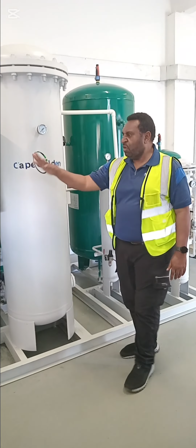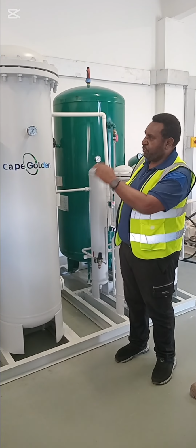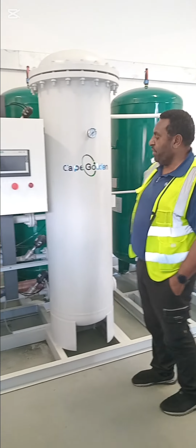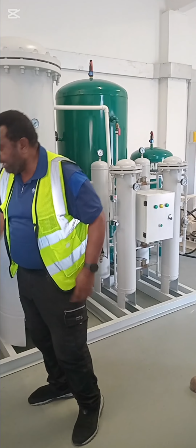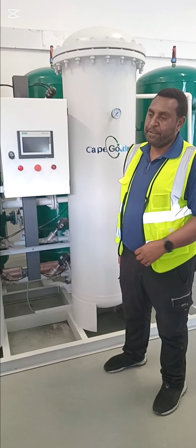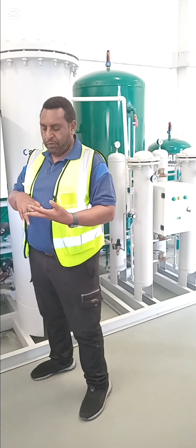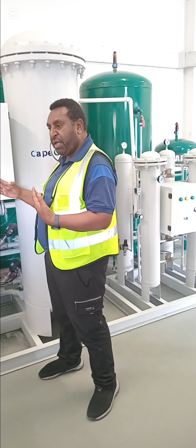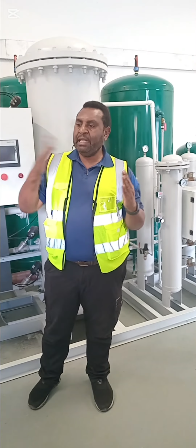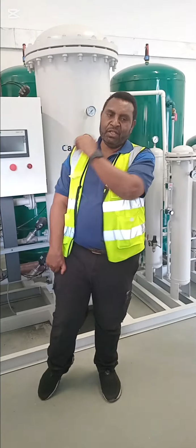On the control side, it's just a control panel, but for maintenance purposes we can go in there. We've got gauges to read the content of each tank, and solenoid valves that control the process of producing the oxygen. We've got 2 feed valves to feed the compressed air in, 2 waste valves to remove the waste, and 3 equalization valves. These equalize the process during the removal of the gas and allow the product oxygen to fill in.